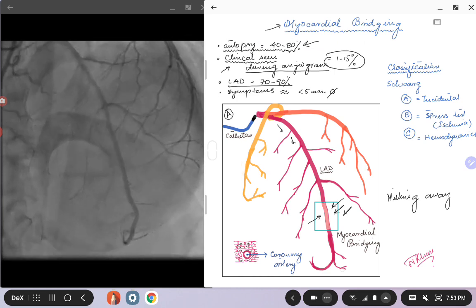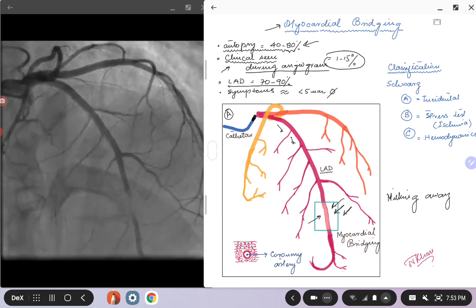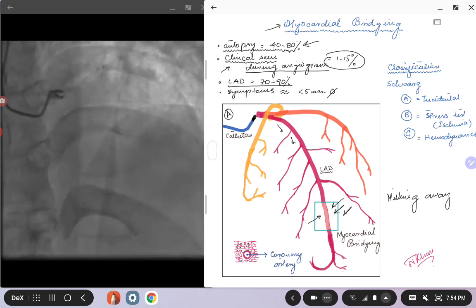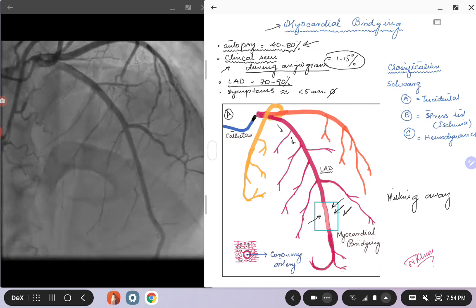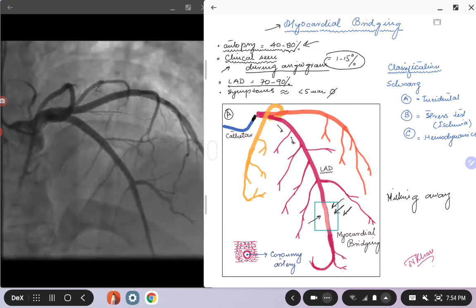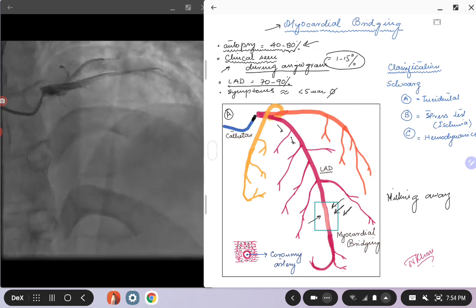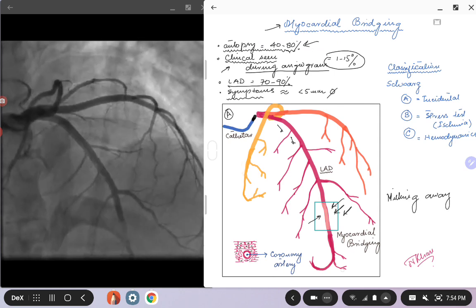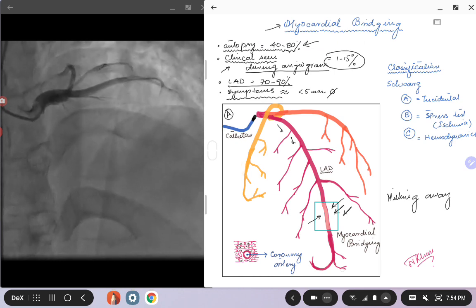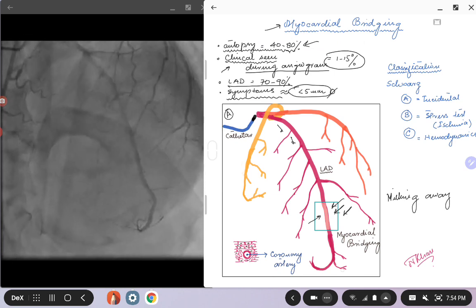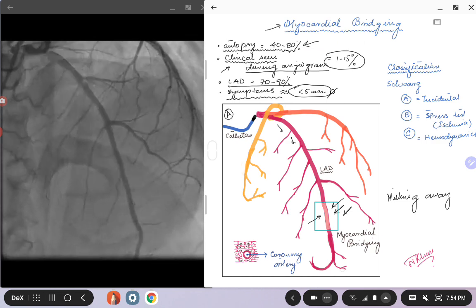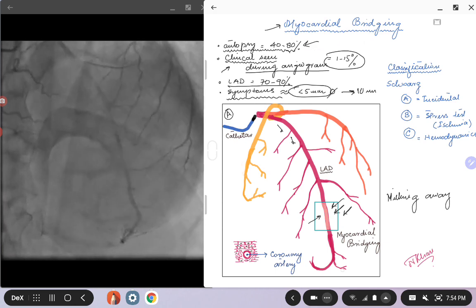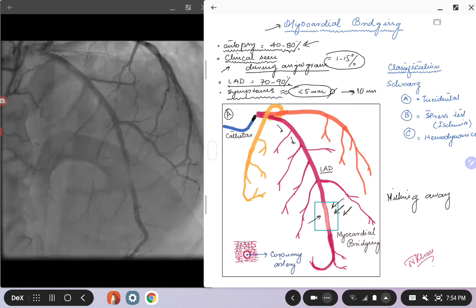By far the most common artery we see with bridging is the left anterior descending artery. From anatomy, the LAD supplies the left ventricle, which has the thickest myocardium, and the LAD has the longest course — so at some point it may dive into the myocardium. If the bridging segment is less than five millimeters, it may not have any clinical significance. It is when a longer segment of the coronary artery is involved that it can be hemodynamically significant and lead to symptoms.